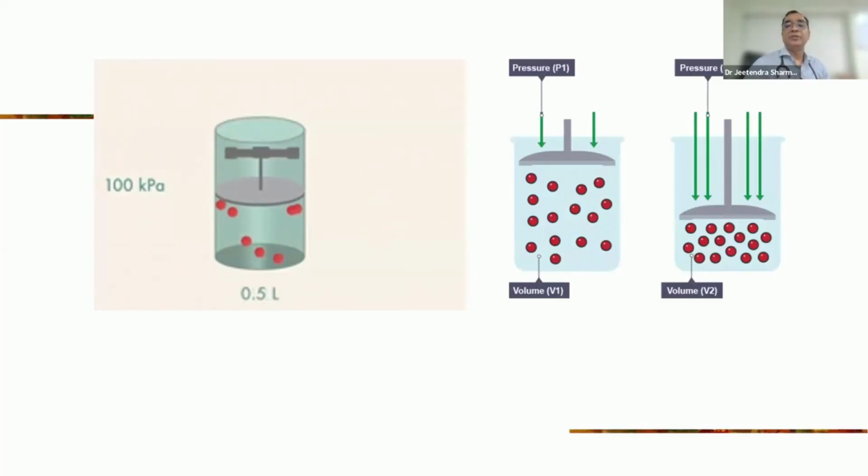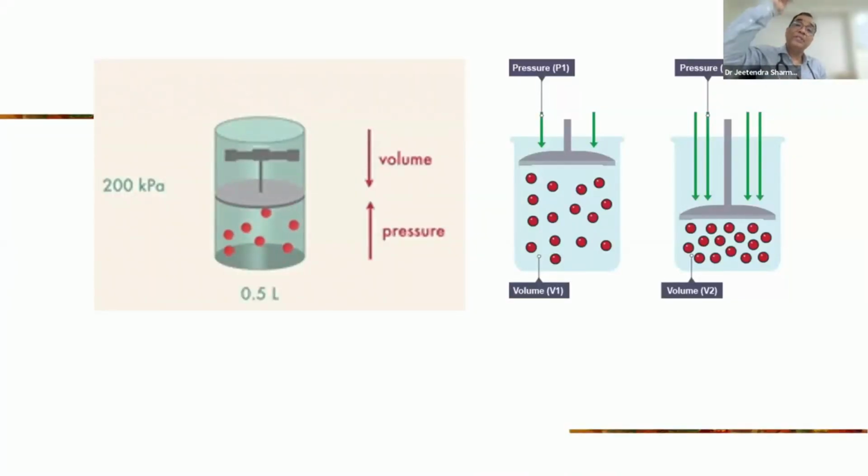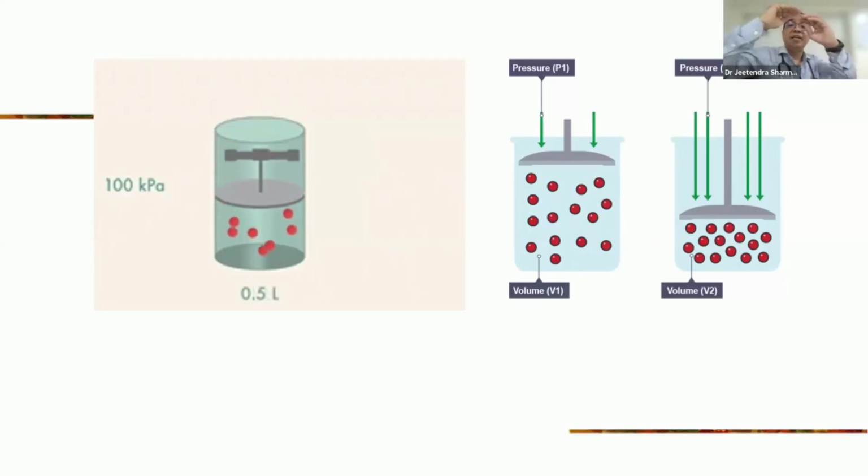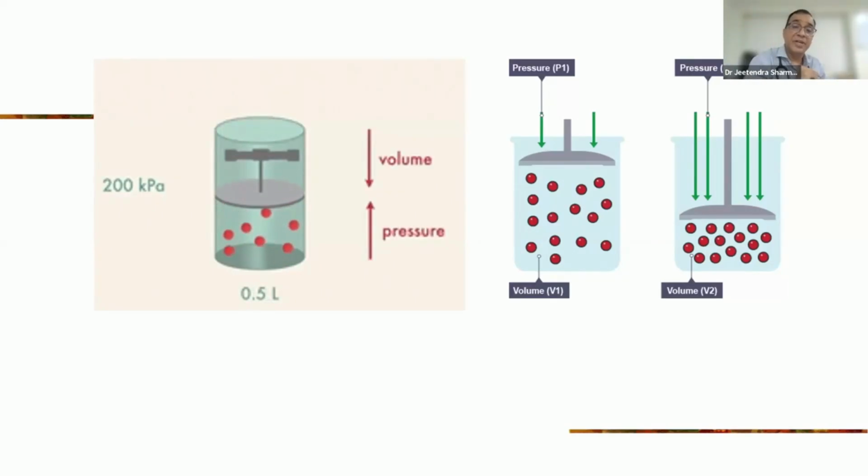So whatever you deliver to the patient, you can measure either in volume, 400 ml or 500 ml, or in pressure, up to this level for this time period.